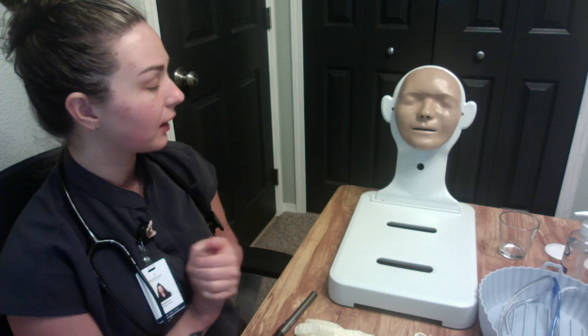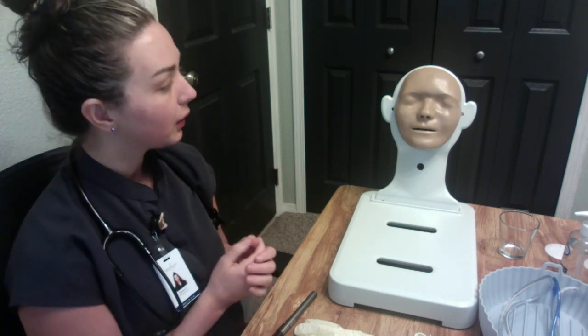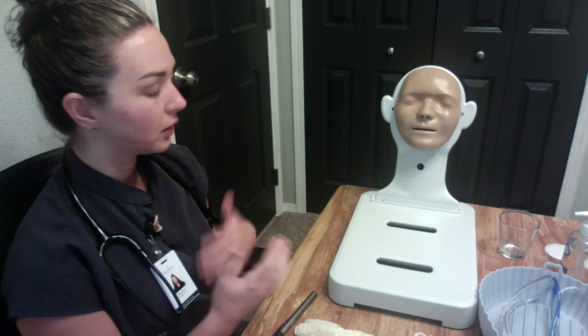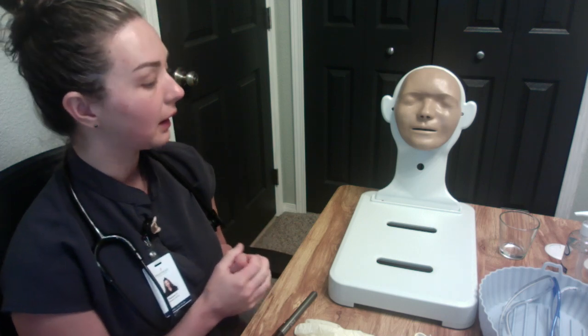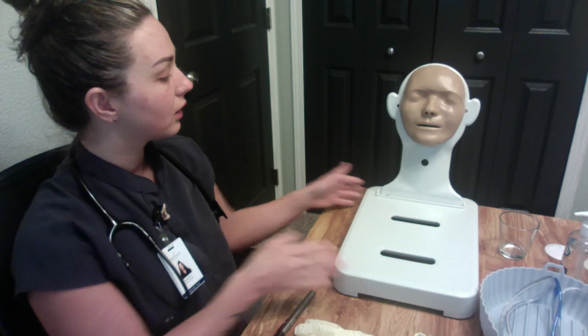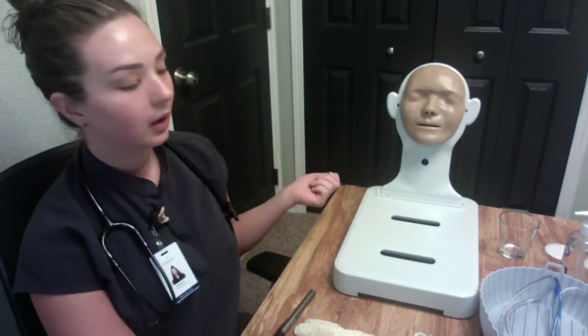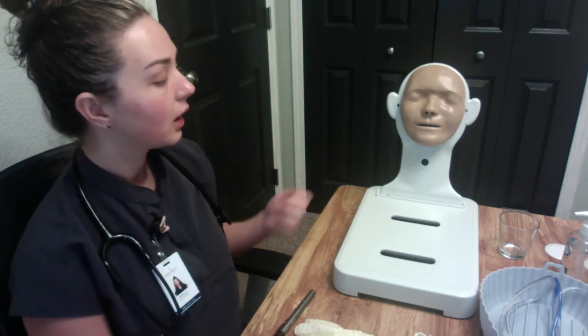All right, Mrs. Smith, there's been an order put in to insert an NG tube for you. That's going to help with some feeding just due to some of the health conditions that you have going on. It'll make things a little bit easier for you, and that way you can get the nutrients that you need. So we're going to first start by raising the head of the bed, bringing the patient into a high Fowler's position.